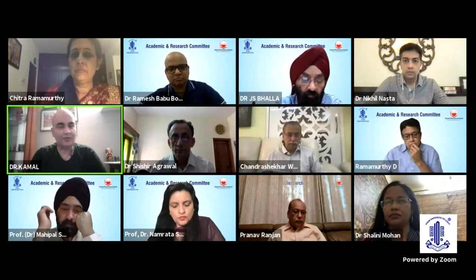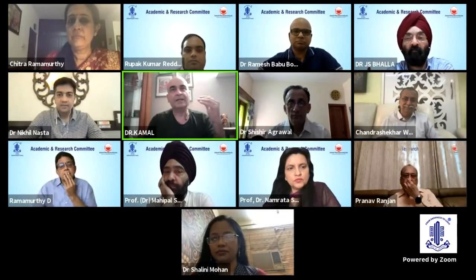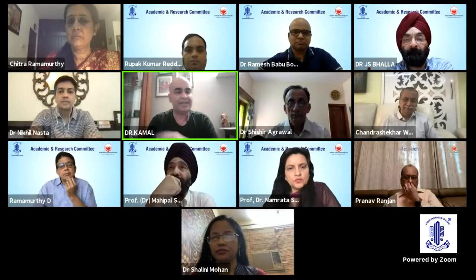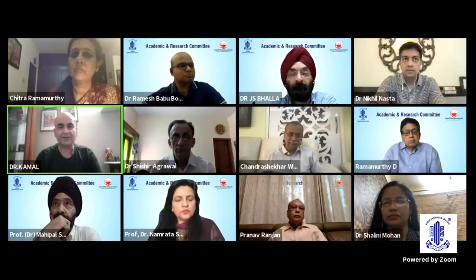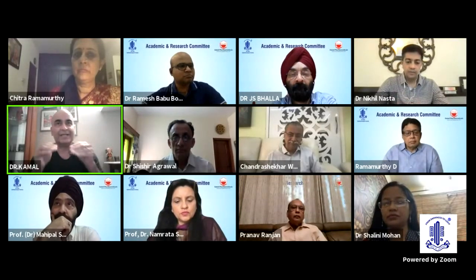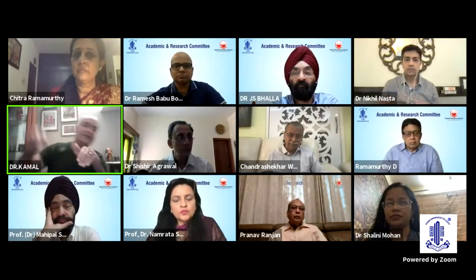Okay, I think wonderful question, Dr. Chitra. As usual, you come out with these pearls of questions which actually split the case wide open for people to understand. The T-rexis I have seen, at least in my hands, I am able to manage any kind of capsular complication. Dr. Maipal and Dr. Namrata were there in DOS again. I showed around 8-9 videos of managing different kinds of complications with the T-rexis. The reason why I do a T-rexis is I always have 2 chances. I make 2 flaps. If the first one starts going out of control, I can get the other one from the other side.